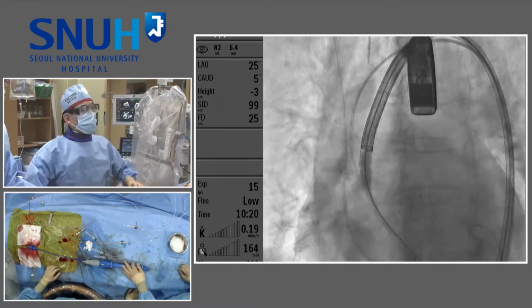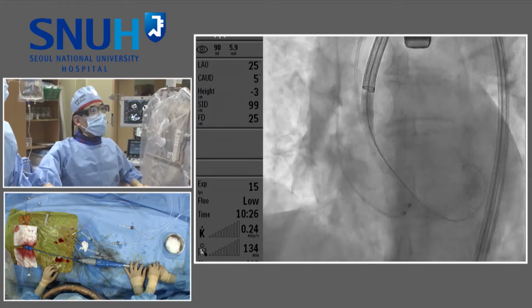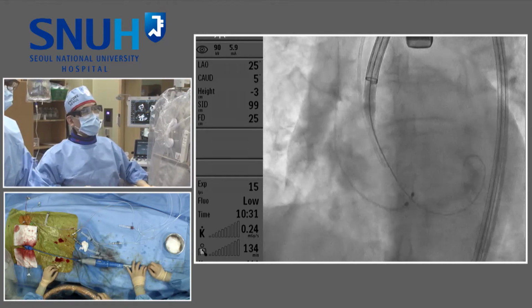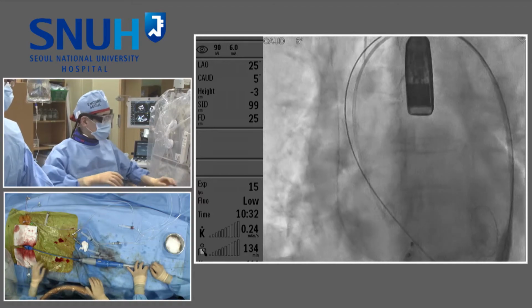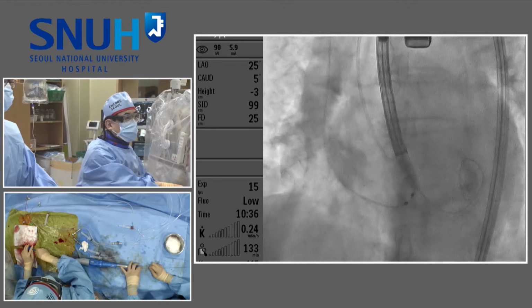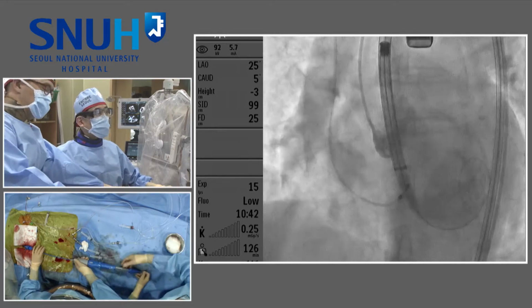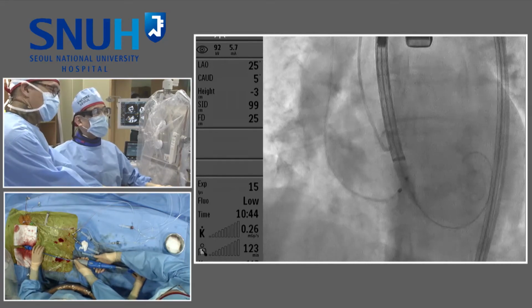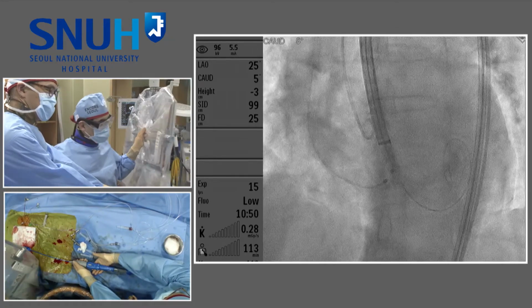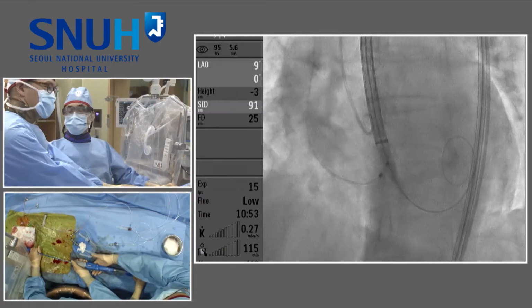Yes, Reggie, one question about access. Ultrasound alone sometimes has a problem. You risk a high puncture with a high bifurcation if you use ultrasound alone. I think using ultrasound alone needs to be done only by true experts. For most others, a combination of ultrasound and fluoroscopy, I think, will be the safest. As a matter of fact, the question was provocative because he showed the drum before, but whenever you start to puncture with ultrasound, practice makes perfect, and it becomes so much easier. So yes, I absolutely agree, but it's just a matter of time before everybody is going to use ultrasound.